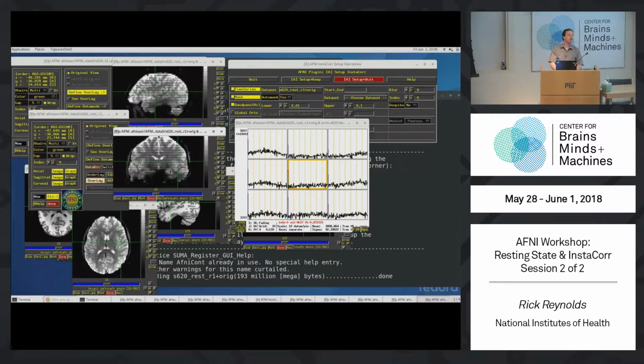If they have plenty of dummy scans, they should be able to afford this. Yeah, many scanners have dummy scans that they throw away that you don't even get your hands on. In general, we might suggest you don't need to let the scanner throw away anything, because you can throw it away whenever you choose to, right?